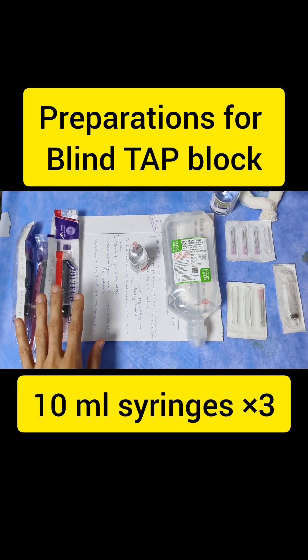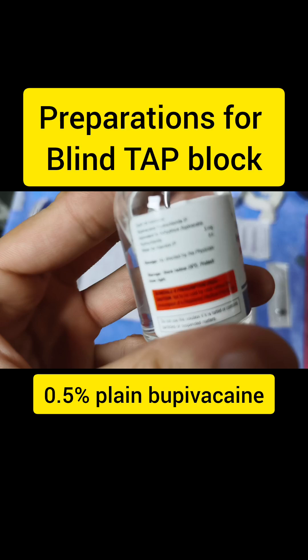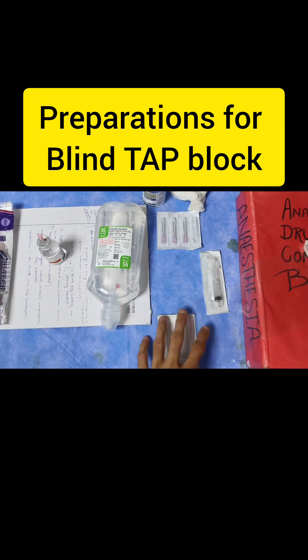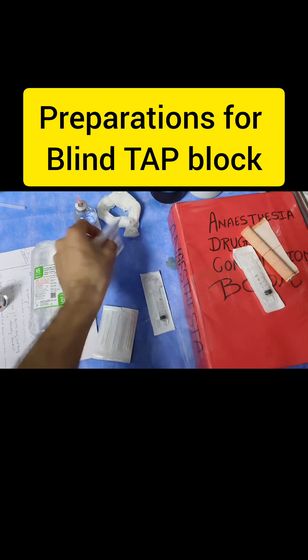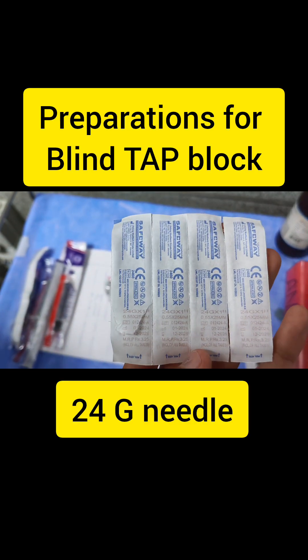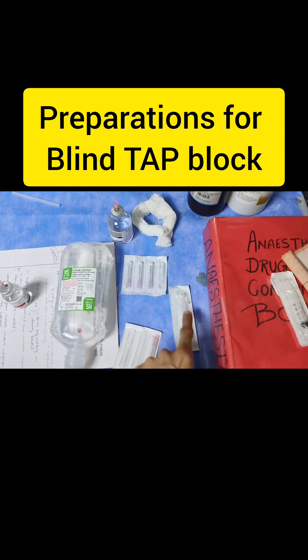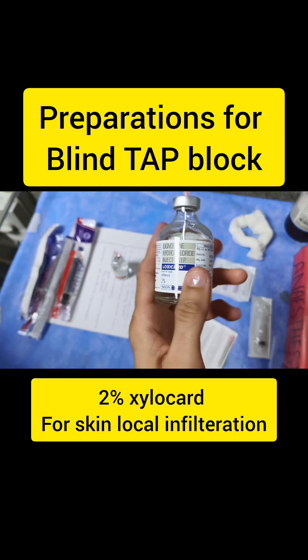We have three 10ml syringes, bupivacaine 0.5% NS, an 18 gauge needle, and this 24 gauge needle. We will use this small needle with a 2ml syringe and plain 2% xylokard for local.